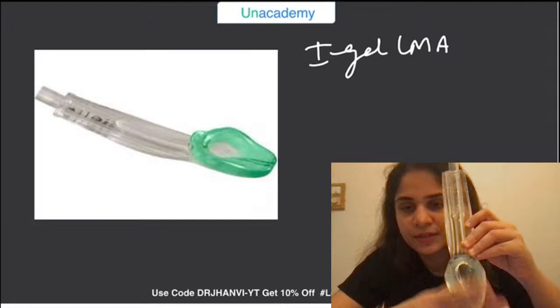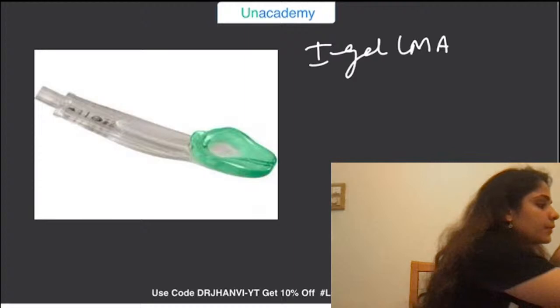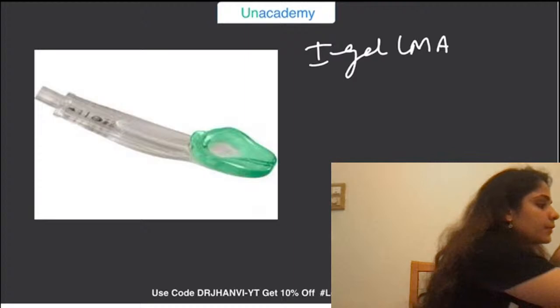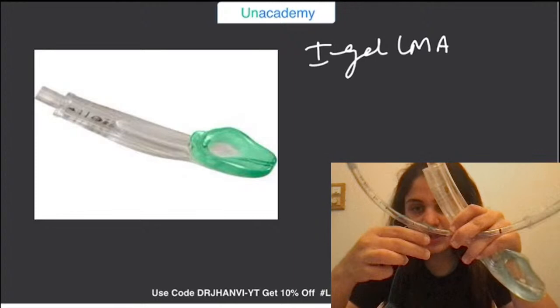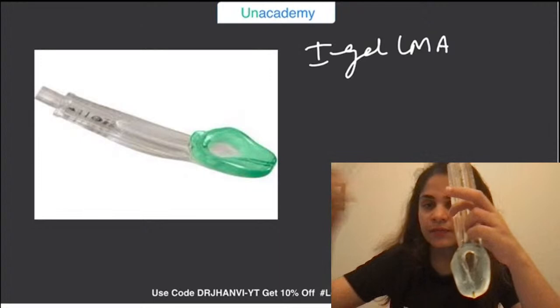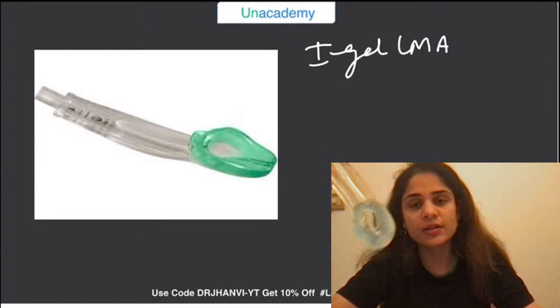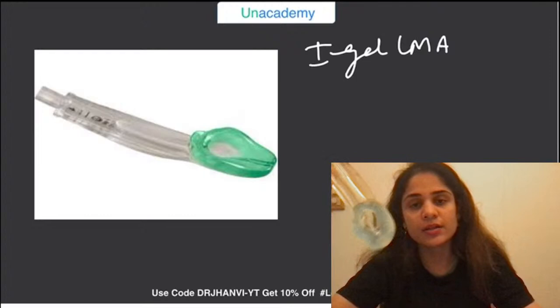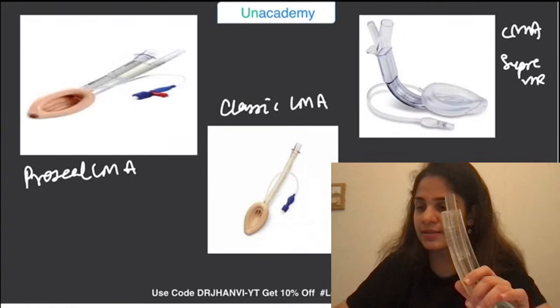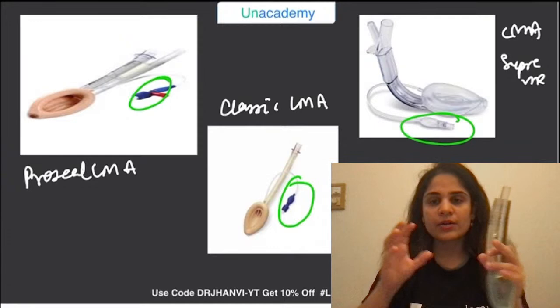This is the cuff of the LMA, which helps in ventilating the patient. Just like the endotracheal tube has a pilot inflation line, pilot balloon, and cuff, similarly an LMA also has a pilot inflation line and pilot balloon to inflate the cuff. This is a cuffed LMA, so you can inflate the cuff using air by attaching it to the pilot balloon.